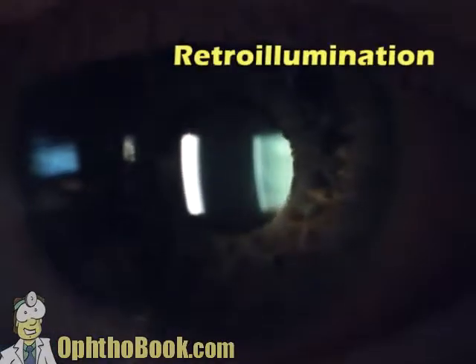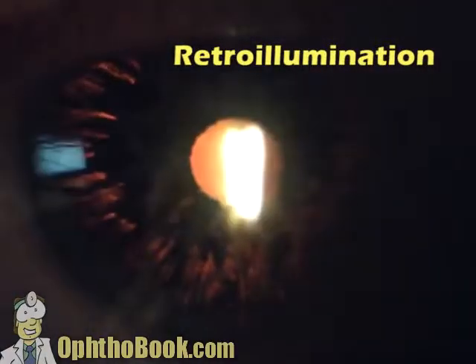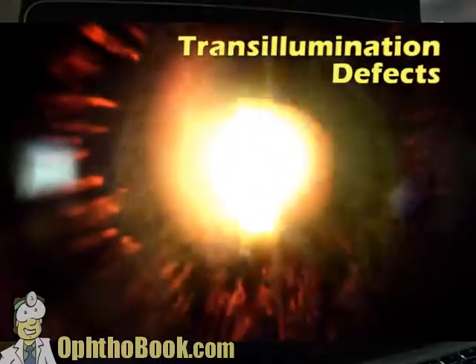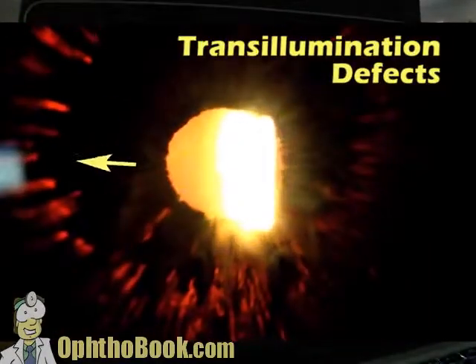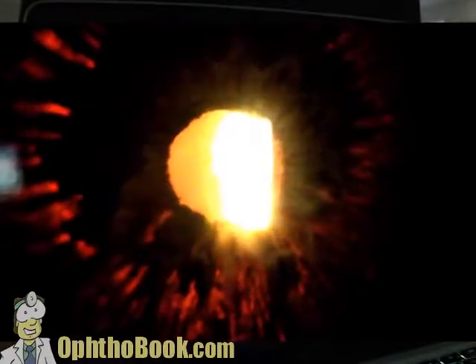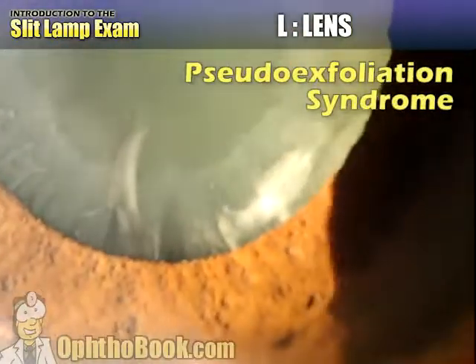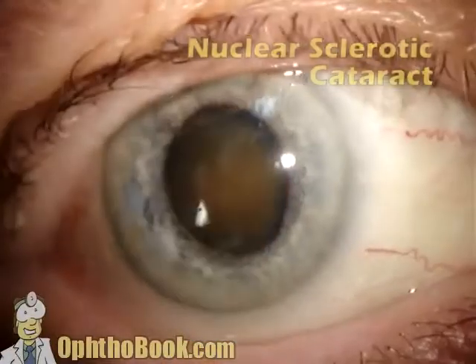Here's the technique of retroillumination where you shoot light straight through the pupil, bounce it off the surface of the retina to get that red reflex, and it shines through the iris. You can see spoke-like illumination defects in the periphery — you see this with pigment dispersion syndrome. You can also see something similar with pseudoexfoliation, where dandruff-like material forms on the surface of the lens, and as the iris constricts and dilates it rubs off the pigment and you can see these findings.